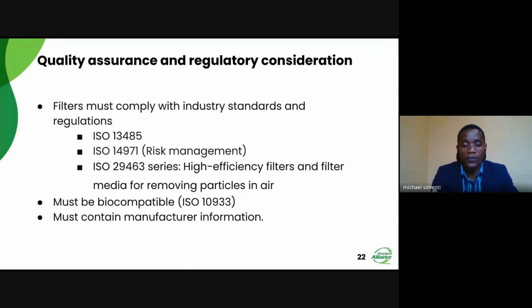So the filter might be okay. The filter might fit well. The filter might be able to remove all particles that are not supposed to be delivered to the patient. But you find that the material used to make that filter is not biocompatible. So yes, a person may get 95% oxygen, but because of the material used to make this filter, that person will react. So it is most important. That's for quality assurance. But again, as engineers, we always need to check the manufacturer information. That will tell us whether the information about that filter from that company is certified or not. Is it certified by any regulatory agency or not? So we need to be conversant with such information.